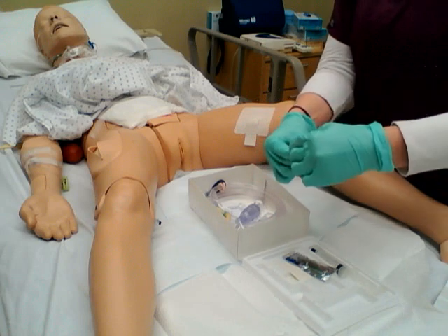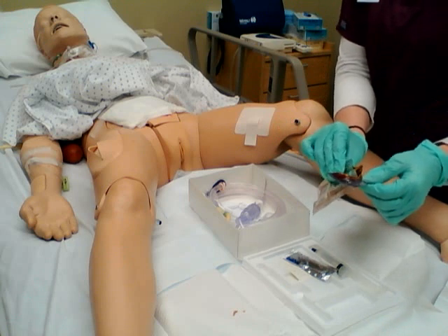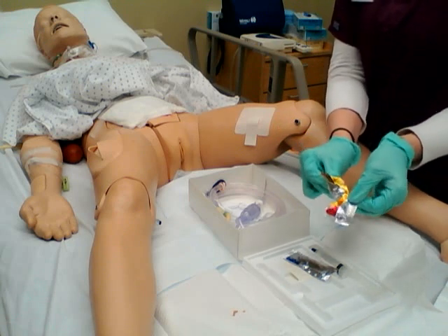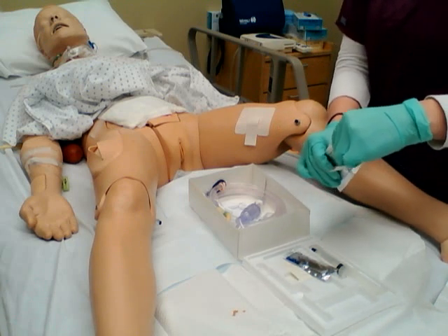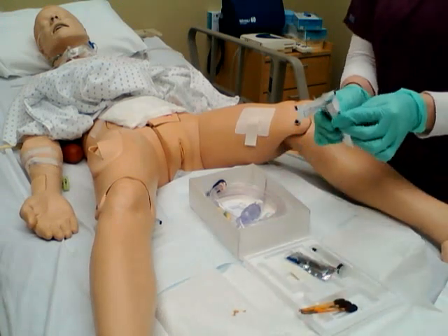I'm going to open up my iodine swabs. For the case of the mannequin, we won't actually be using the iodine swabs, but they are going to be out and ready, treating it as if it was a real patient, so that we can get that patient sterile to prevent infection.